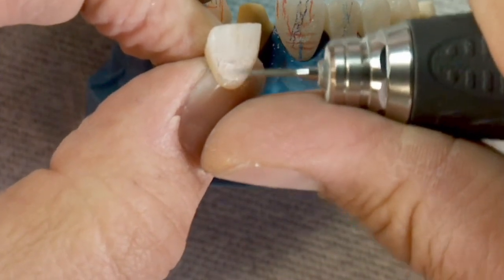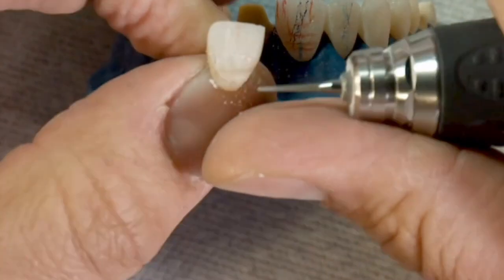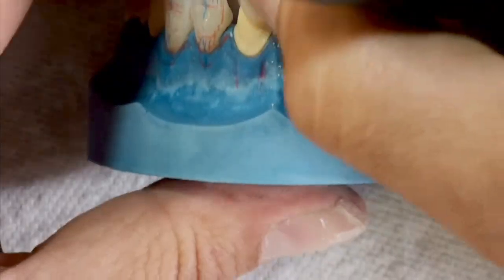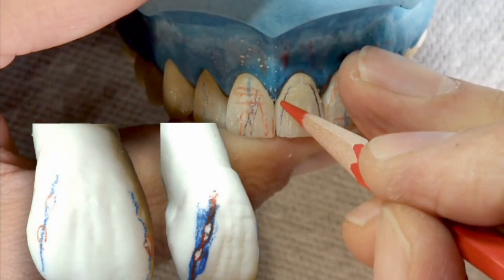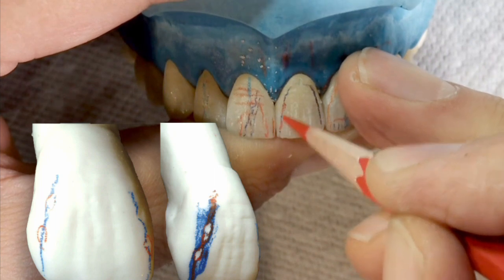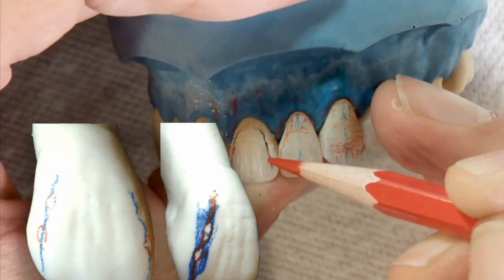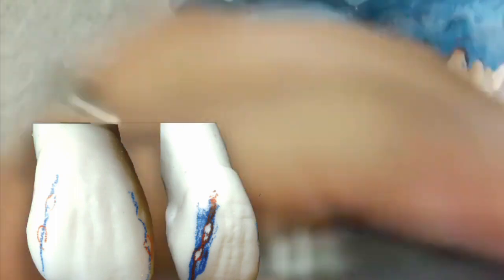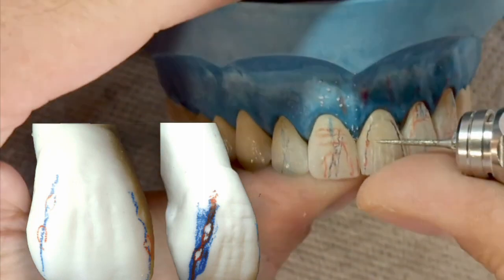We reproduce the wider and deeper depressions with a diamond burr, then use our modified tungsten tip to trace the finer lines in the center of the tooth. The deeper depressions cut across the transitional line angles and go all around the tooth, which is why we can follow the same procedure — drawing on and grinding on — to the side of the tooth as well.